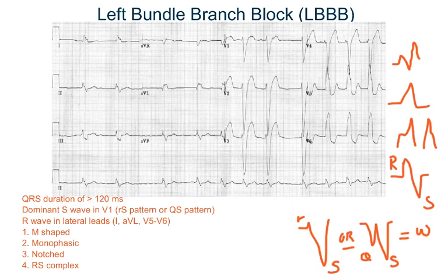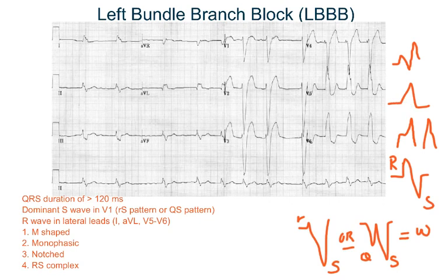And if you see the letter M in V1, it's right bundle branch block. In right bundle branch block, we looked at the S waves in the lateral leads. In left bundle branch block, you look at the R waves in the lateral leads. The R waves could be either M-shaped, monophasic (just one R wave with no Q or S wave), notched like in this ECG — look at lead 1, V5, V6 — or it could be an RS complex.